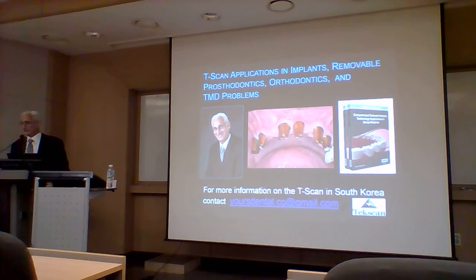Here in this country, we know there are T-Scan users who have the T-Scan and they use it, but they aren't always sure what they're doing. And in my own country, people take courses from me and they say, I didn't know that feature did that, and I didn't know that I could do that, and I didn't understand that, and yet they've had it for 5 years, 7 years, 10 years. So the training is the negative point. You have to really learn to use it for it to work. If it doesn't work, you should take it out of the box.